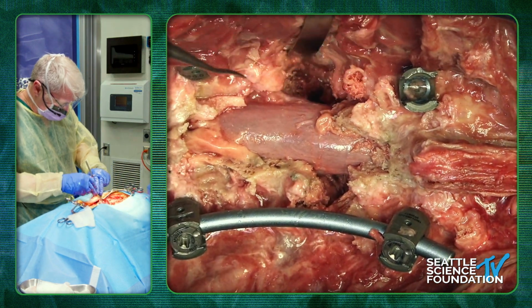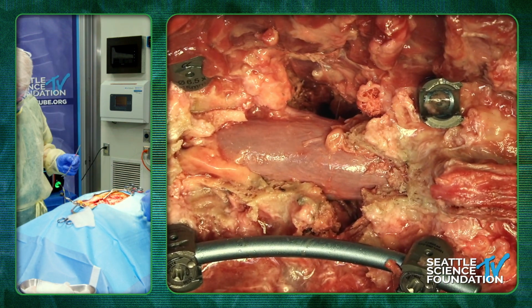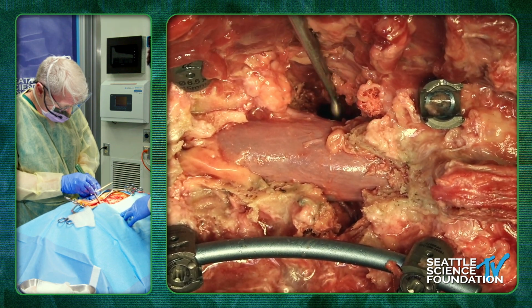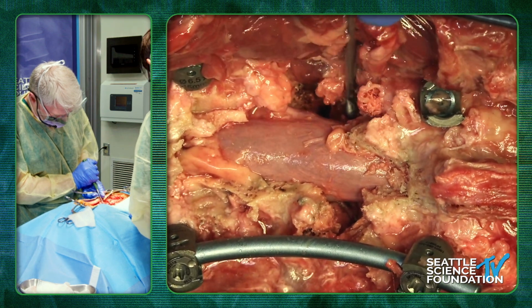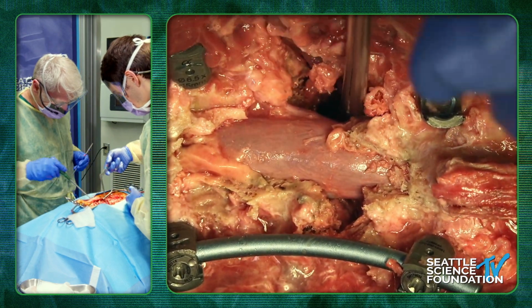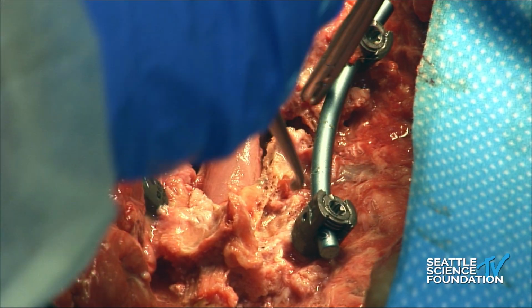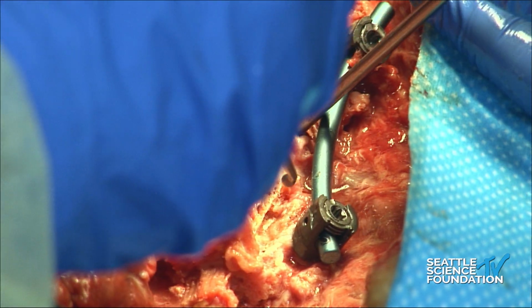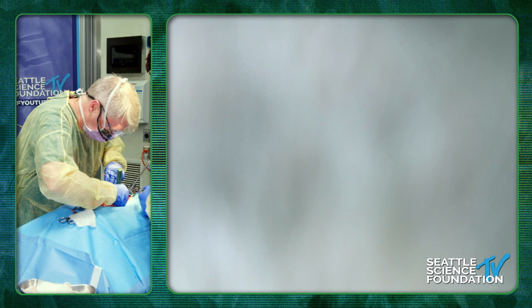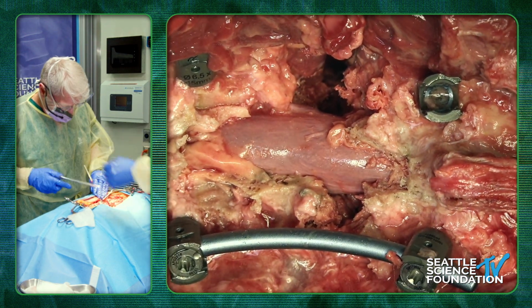Okay, good. So now we're going to make sure our posterior wall is all dealt with. Okay. So we usually have extended backward down curettes, which are aimed down, and we'll take out the back wall here. Okay, you want to take all that out? Okay, and then just make sure you're clean on your side. You see that piece there? Yeah. Okay, great. Okay, I can get it from my side. And now we're pretty much done here.